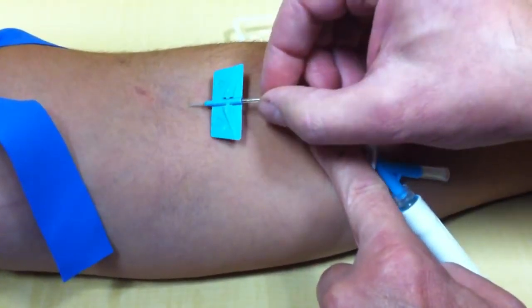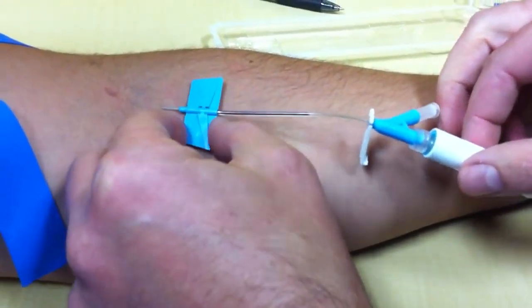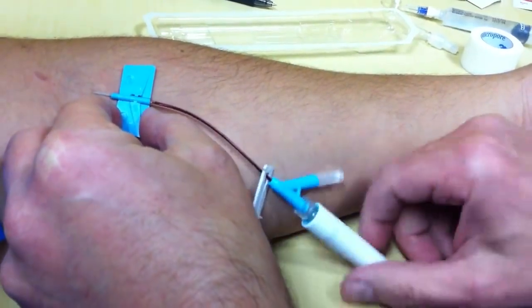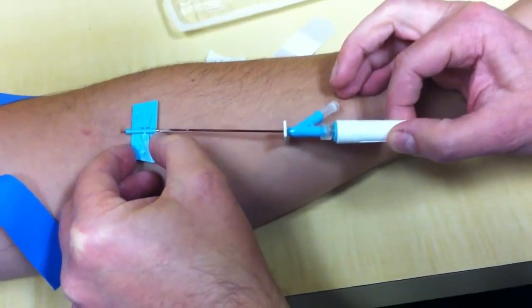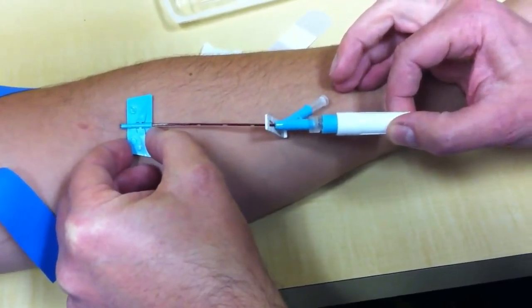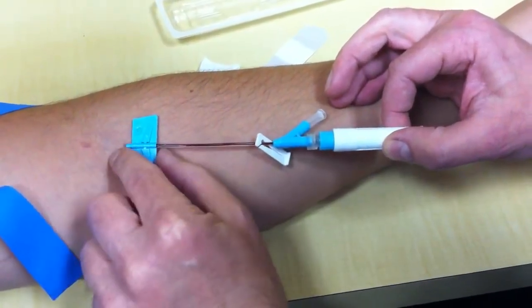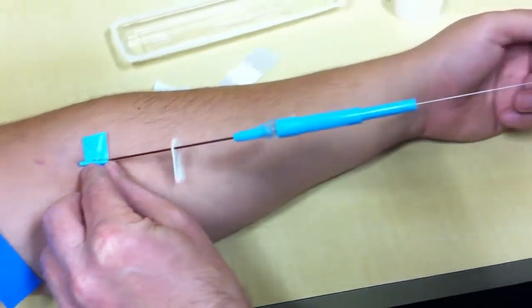A little deeper — there it is. See the flash? Pull the needle out. Advance the catheter like this — I'm pushing the catheter, I'm not pulling the needle out. I'm not allowing the needle to go forward when I'm advancing the catheter. So the needle, once it's in the vein, does not move. You advance the catheter, holding this in place. Once the catheter is all the way in, then you pull this needle out and it'll pop.